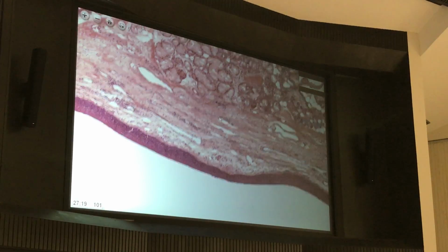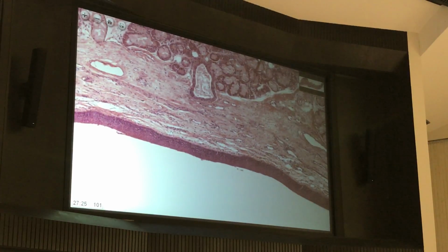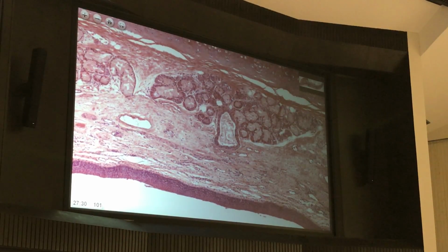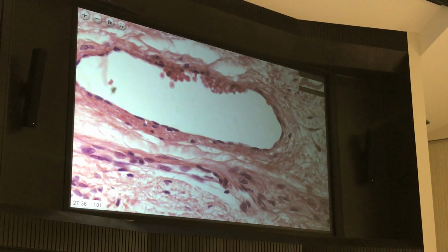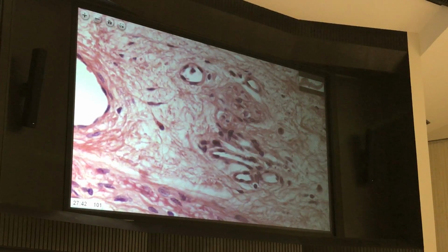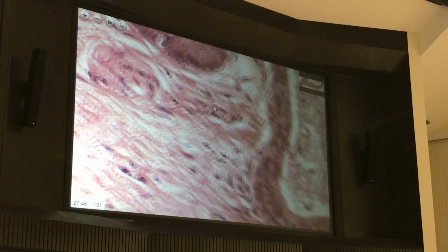And then when you start seeing things like this, these are just glands. There's a little adipose tissue. Let's see what this is. We're going to look at these two structures here. Would you say this is a duct? What would you say? No, look, it's got the blood in it. So there's your simple squamous endothelium. Blood vessel, there's a little blood vessel. All of these are little blood vessels. Compare that though to this. Where did this guy go? Oh, here we go.